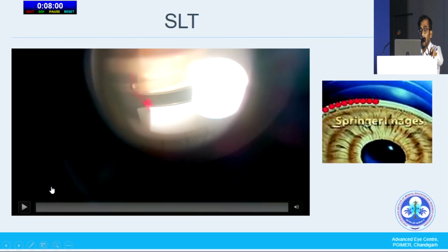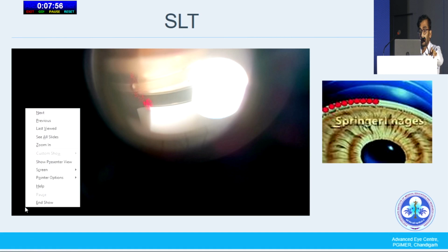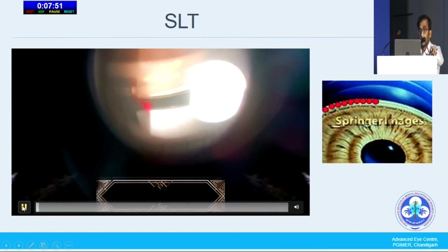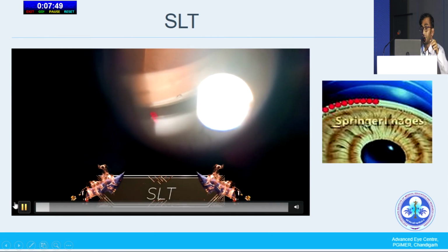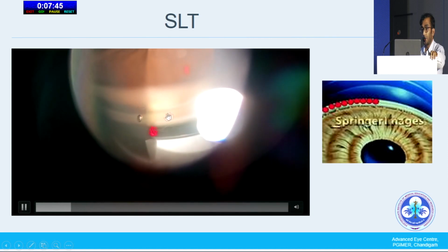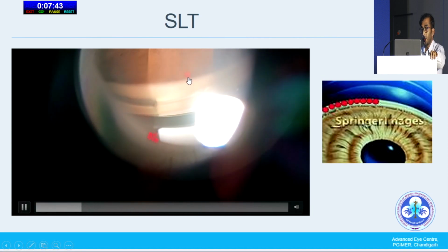So I tried to get a small video. If you are expert in gonioscopy, this is a very easy procedure.